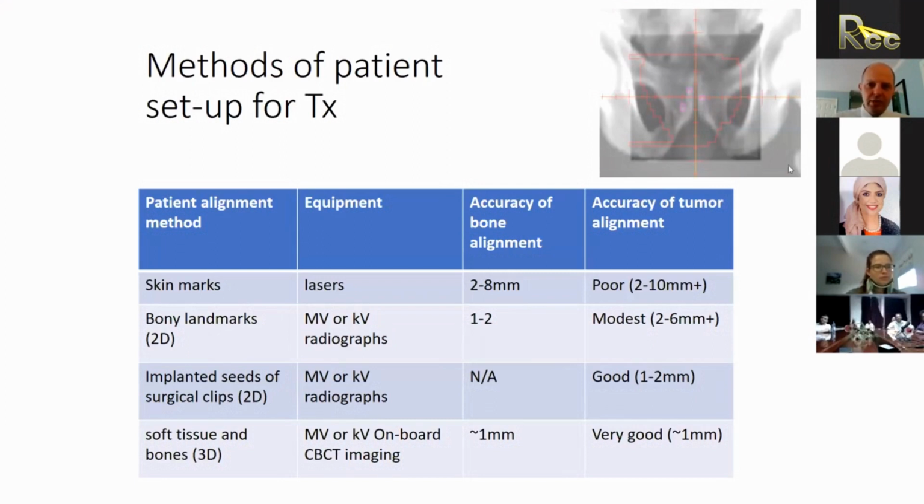It acquires a partial projection image that's one side plus a little bit to the other side, and so you have to take a full 360 degrees for that scan. So you'll have a full rotation of the gantry, from negative 180 to 180 basically.